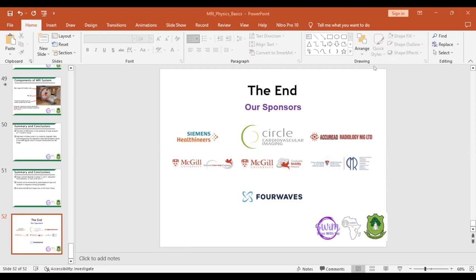And then the next is the selective excitation, which tells the scanner which anatomy of interest you are trying to image, and then excites the spins only within that portion. When the sequence starts running, the frequency encoding section does not give you the final image yet.